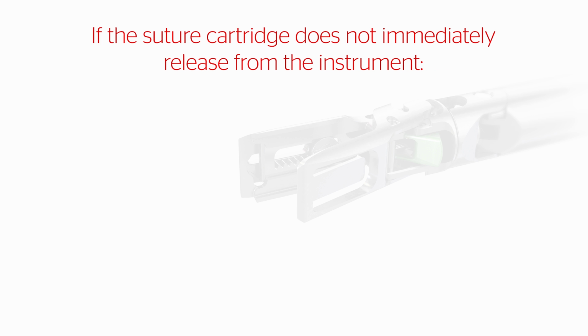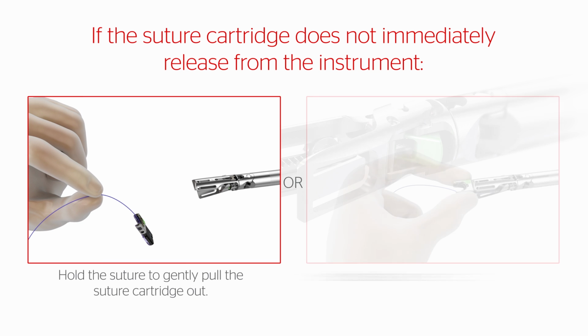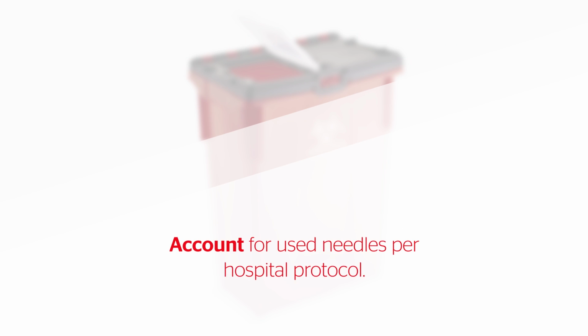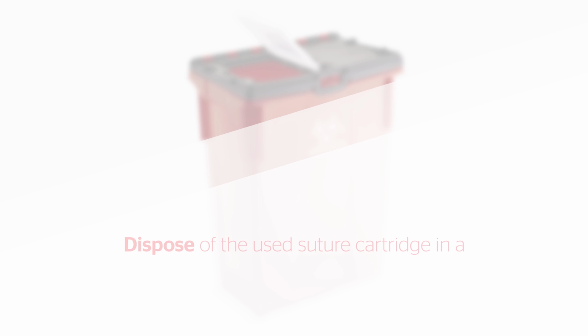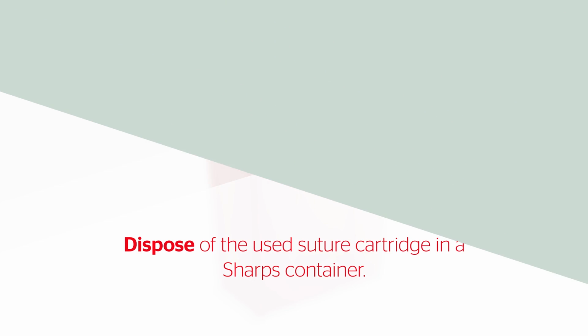If the suture cartridge does not immediately release from the instrument, hold the suture to gently pull the suture cartridge out, or hold the sides of suture cartridge with index finger and thumb. Account for used needles per hospital protocol. Dispose of the used suture cartridge in a sharps container.